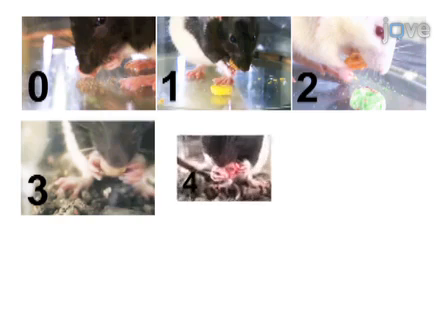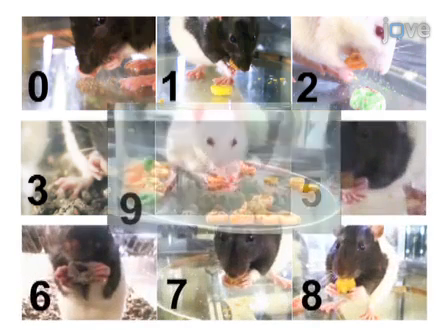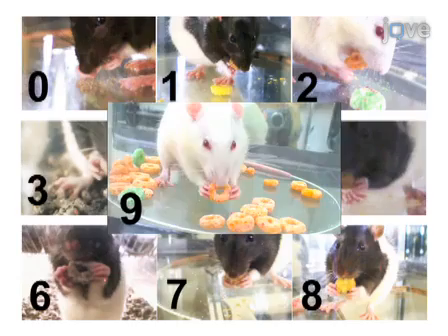The IBB shows a consistent pattern of recovery that is sensitive to injury severity. Furthermore, the IBB scale can be used to assess recovery following other types of injury that impact normal forelimb function.